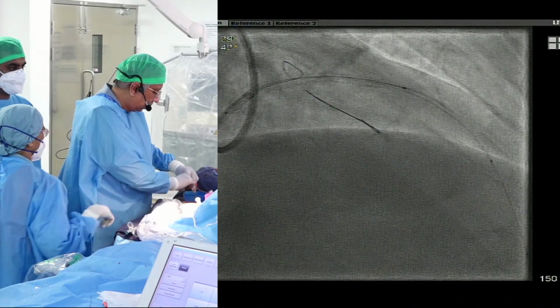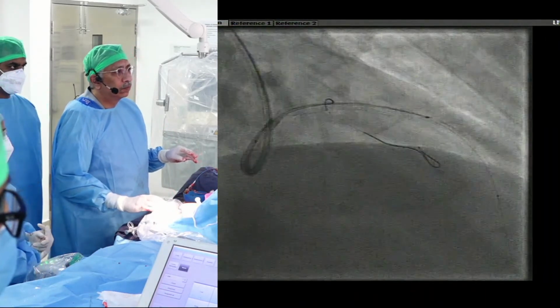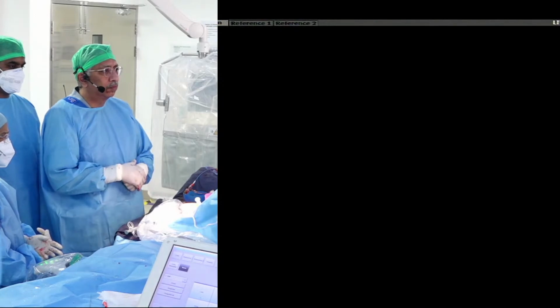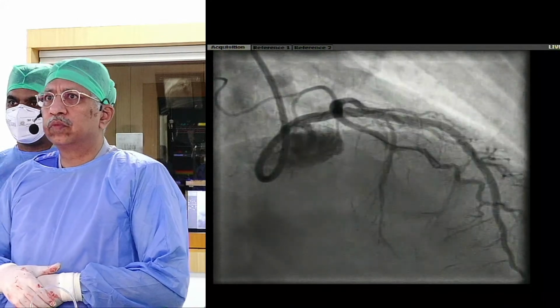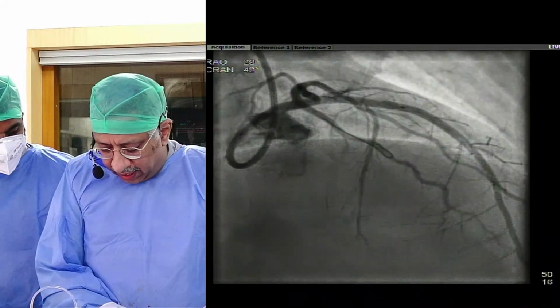The coronaries are looking much cleaner. You look at the OCT imaging, and you can see very clearly that there is some thrombus there. Very clearly, there's a plaque erosion with the thrombus. The lumens are very big, more than 2 millimeters. And in this sort of scenario, we don't stent these patients. So now let us have a look at that. Actually, no stents in this.